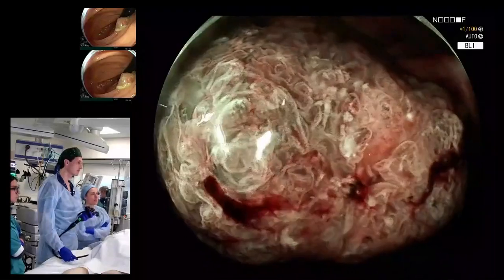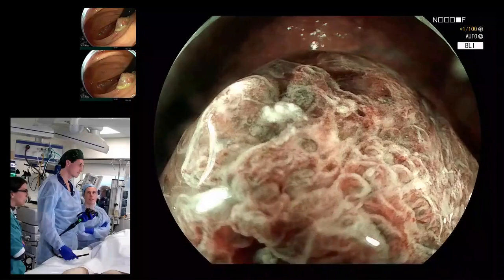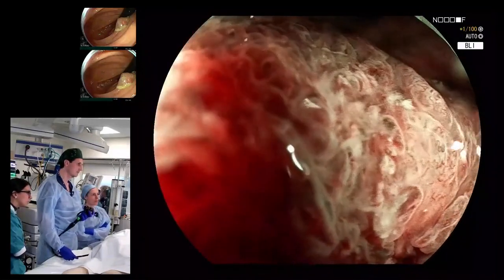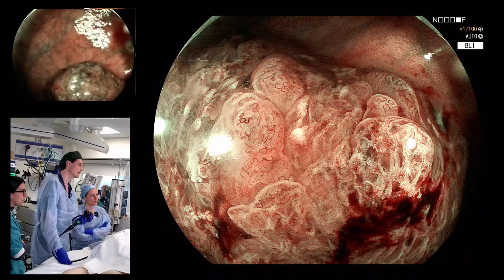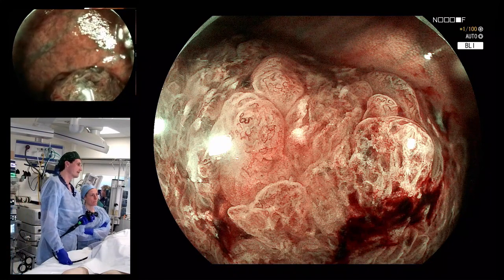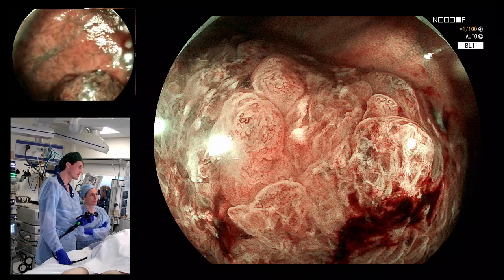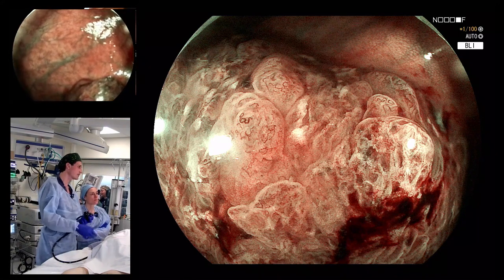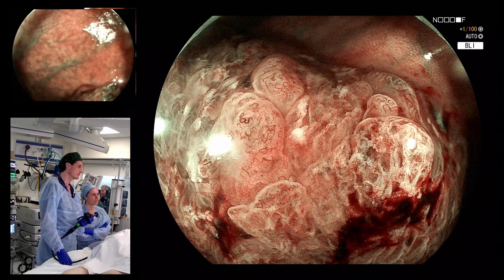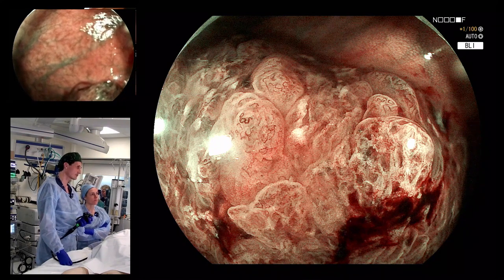And what about the regularity of it? Let's maybe indeed you focus now, right? You've zoomed. Maybe just stop it. Yeah, to me it looks pretty regular, most of the polyp. It's not all very easy to interpret with some of the blood and some of the mucus still on, but I have not seen anything that is raising a lot of concerns right now.